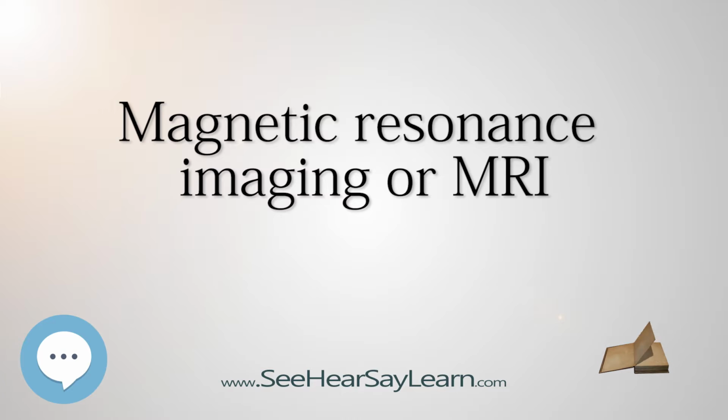Interventional MRI. The lack of harmful effects on the patient and the operator make MRI well suited for interventional radiology, where the images produced by an MRI scanner guide minimally invasive procedures. Such procedures must be done with no ferromagnetic instruments.